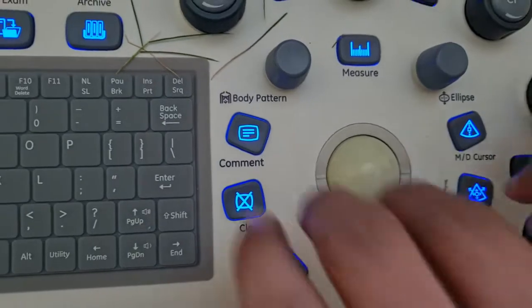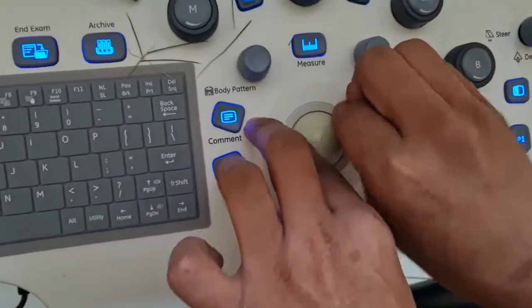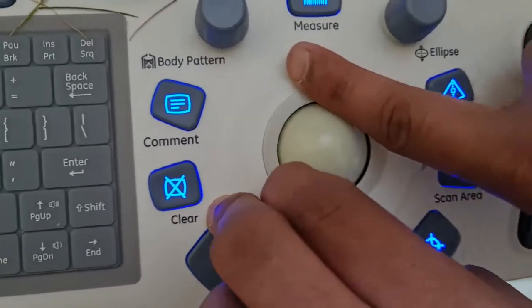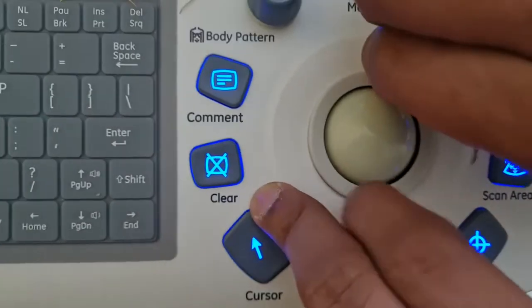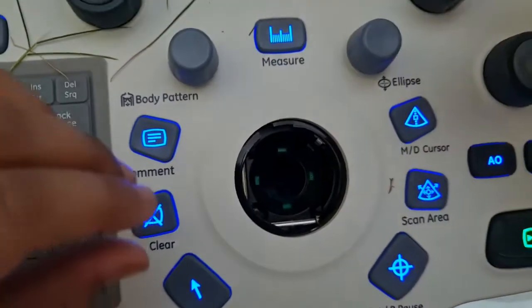See, it is moving. You can clean it once or twice in a week. It comes out like this.